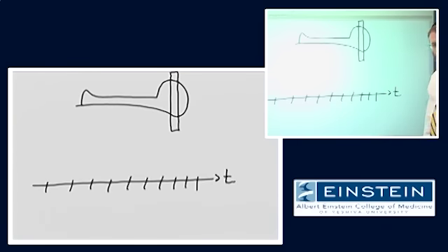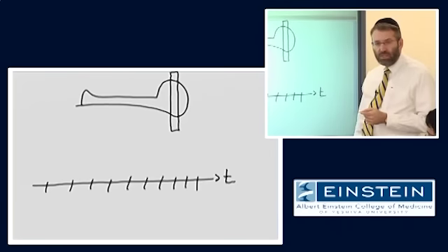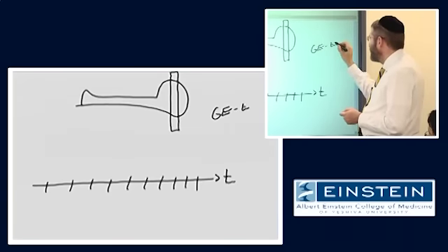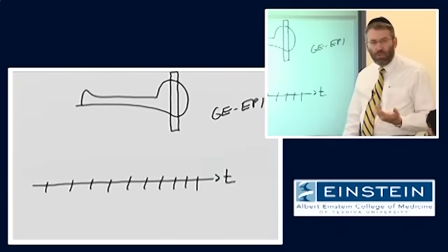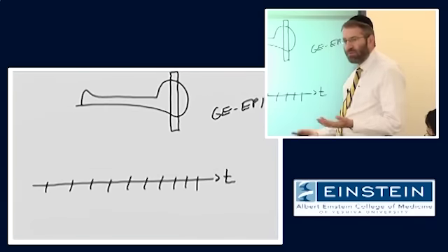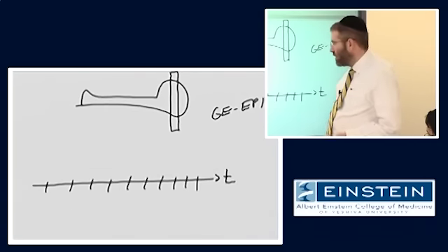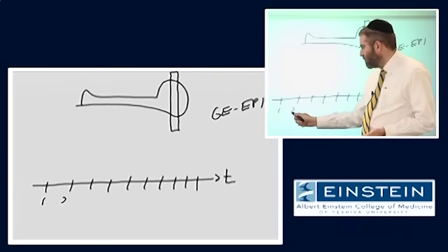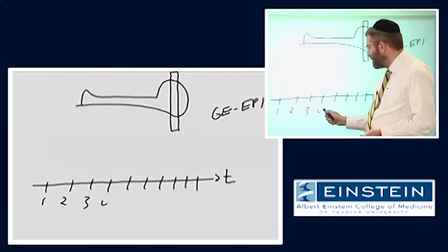So I'm going to use some very fast imaging technique that's very sensitive to these magnetic susceptibility effects. Something like gradient echo, echoplanar imaging would be one potential choice. You could use fast gradient echo imaging. You could use whatever you want. And let's say we image at intervals of 1 second.